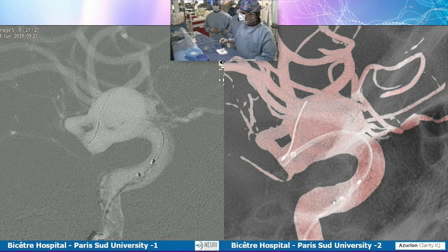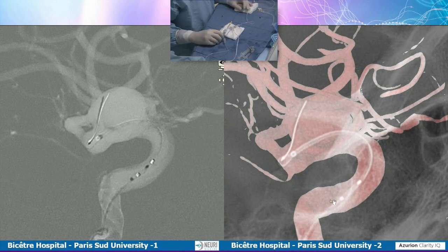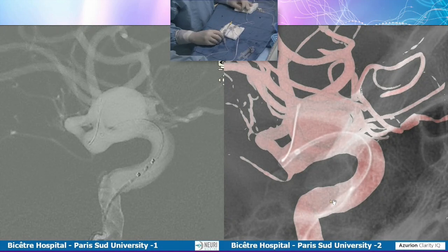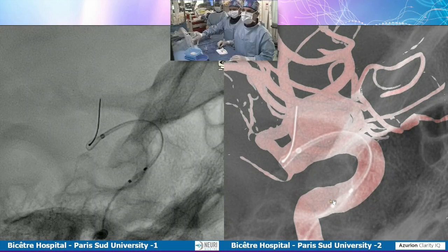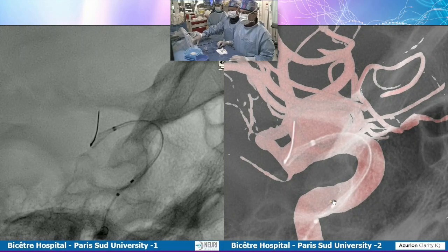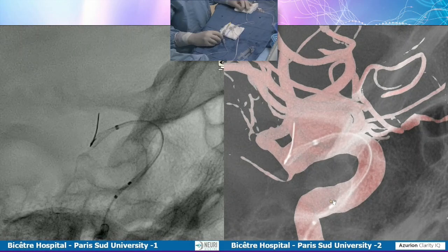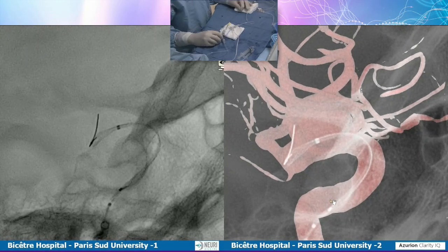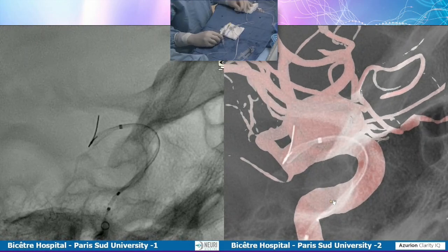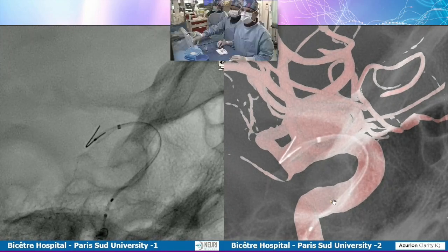Is using the electronic zoom. As you can see on the left side of the screen, everything is controlled by the tablets. It's like a smartphone. You select, you recall the view, you change the runs, you fix your smart mask.